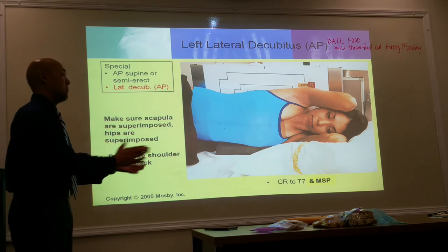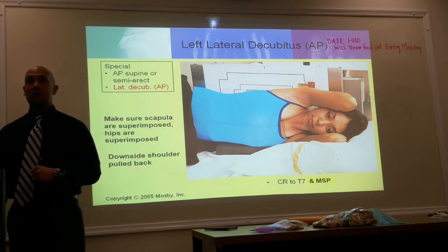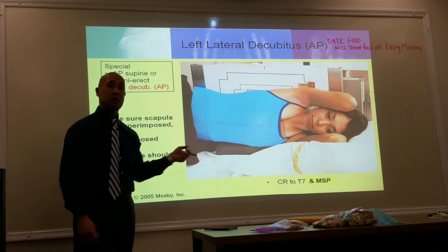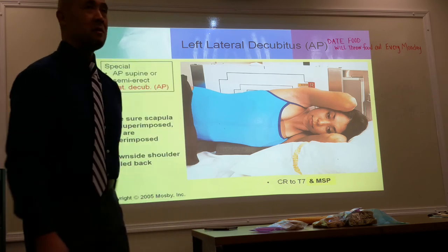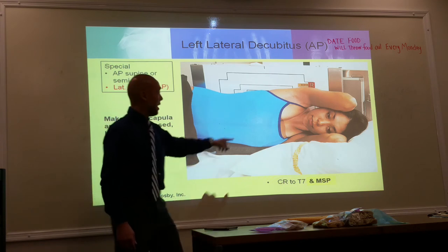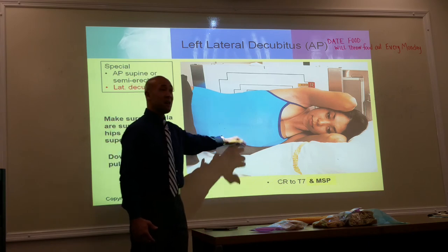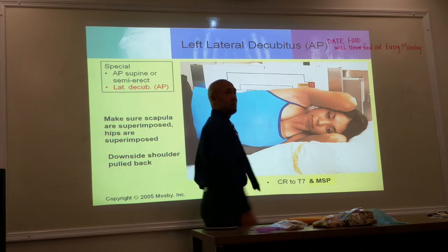Now, if fluid, what position are they in right here? Lateral. Okay, it's a decubitus, but it's a left lateral decubitus because they are laying on their left side. Is it an AP or PA projection? It's an AP projection. You can also do a PA projection with them laying on their left side, except their head will be at the opposite end. Does that make sense? They're still on their left side, but if their head was at the opposite end, now they'll be laying like this. That's PA.